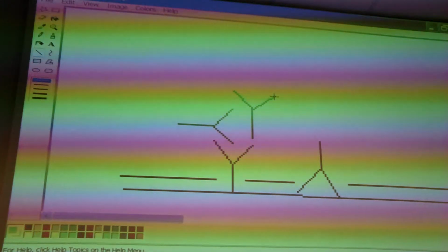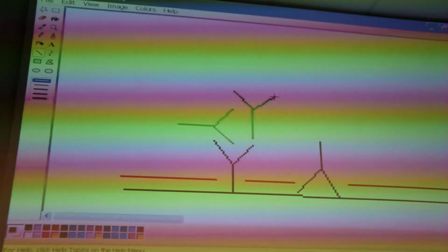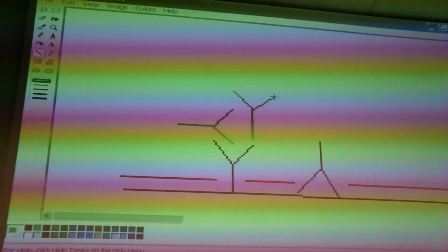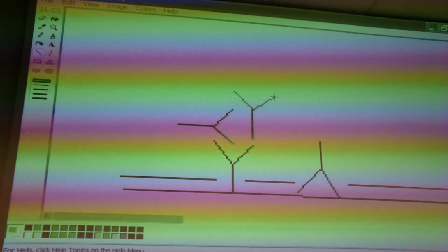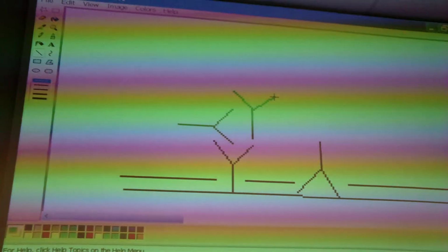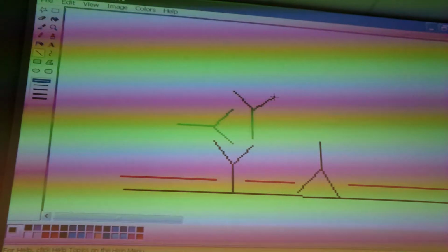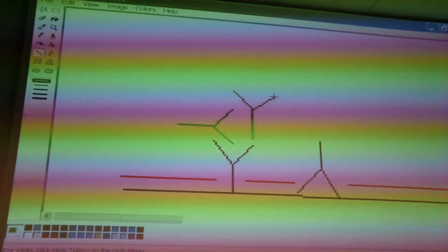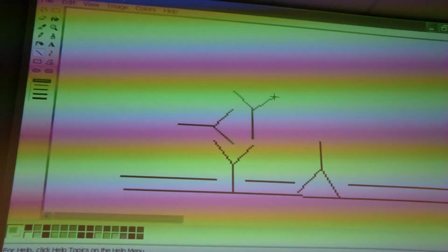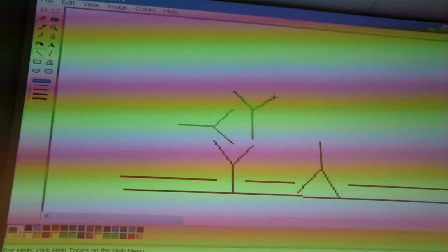I'm not sure how much immunology you have. It was like 3 years ago. Yeah, the light chain essentially doesn't switch between the isotypes. So it's either kappa light chain or lambda light chain in humans. So if you want to do an isotype specific ELISA, you cannot have one that is also directed against the light chain because it will cross-react with all the isotypes. In this case, it really depends what you want to measure. If you want to measure IgG specifically, you need to find an antibody that doesn't cross-react with light chains. You need an IgG FC specific one ideally.